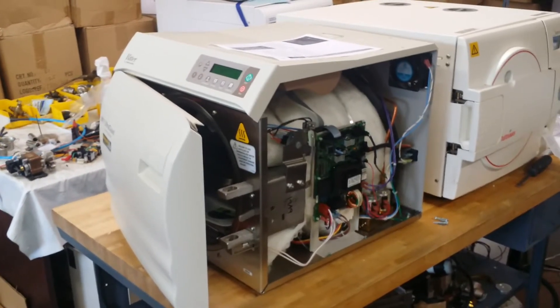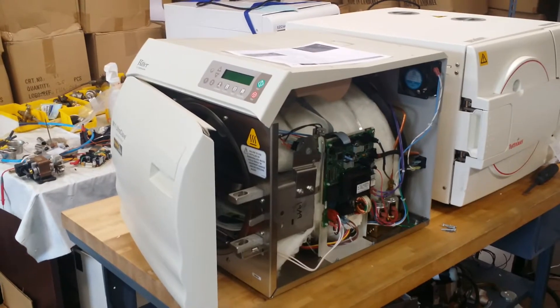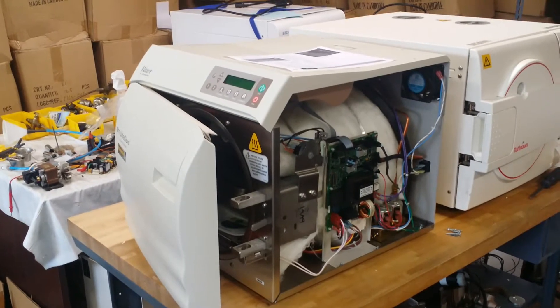Hello, good morning. This is James from iSterilizer.com. This video shows you how to repair Midmark sterilizers — the Midmark M9 and M11 autoclaves.